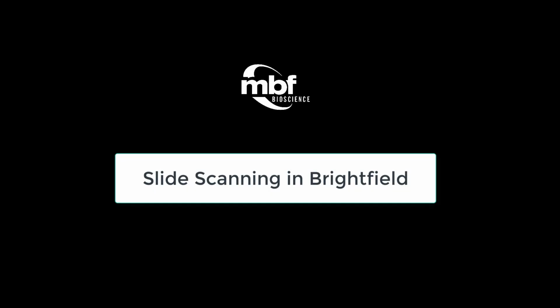This video covers slide scanning in Brightfield. It's a good idea to familiarize yourself with general imaging in Brightfield first, so check out that video if you haven't already, and then come back here.